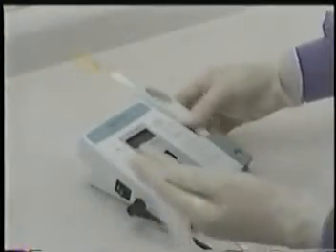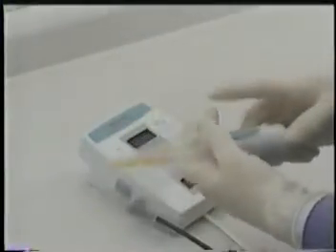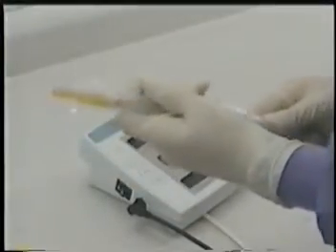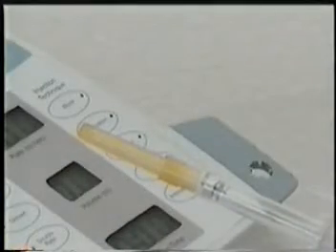Before the injection, Midwest recommends that you cover the handpiece with a disposable sleeve, as is typically used to cover dental low-speed motors and air-water syringes. Pull it down past the cartridge sheath so it covers the handpiece but does not obscure the anesthetic cartridge. Select the appropriate injection type.